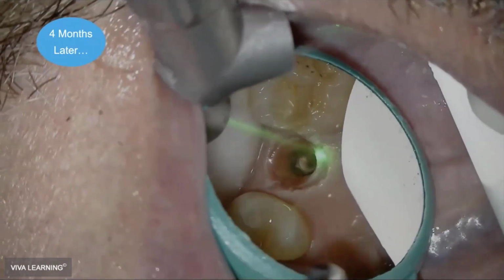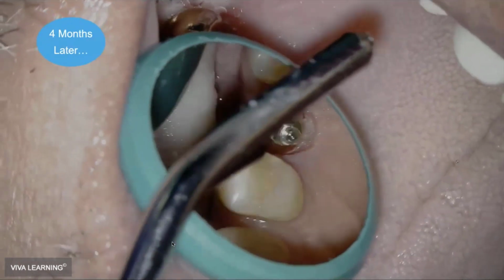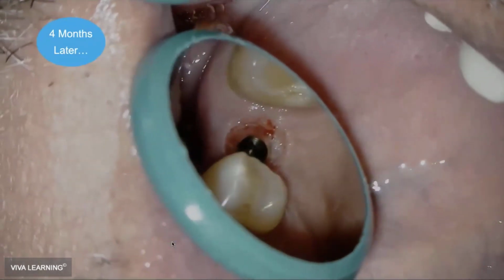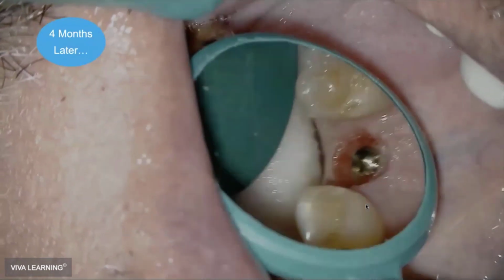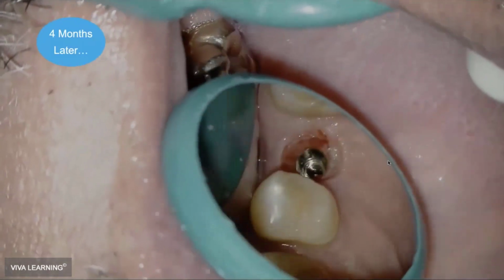And like we mentioned before, you can obviously do this retroactively as well. A lab may just send you a perfectly idealized emergence, and you can just try to seat it. And when it won't seat, you can then do this. It's a little bit more of a guessing game when you do it that way. But this would be my preference, to go ahead and do it before you capture your impression.